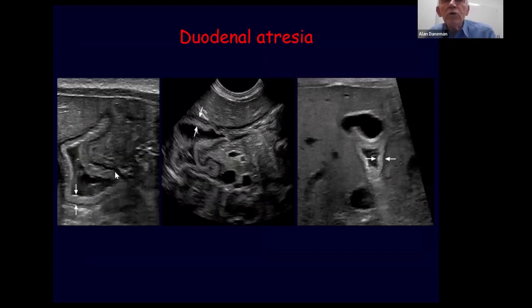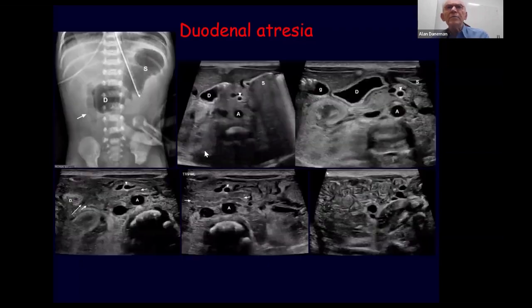You can also use ultrasound, which has been used in recent years to document the fact, say that in a duodenal atresia, the wall will be thickened and hyperechoic due to edema of the wall proximal to the obstruction. And sometimes the gastric wall is also hyperechoic and thickened. So ultrasound can be quite useful in these patients.